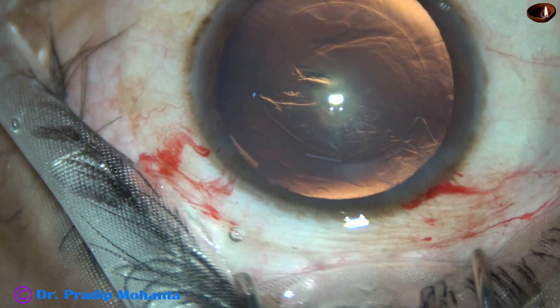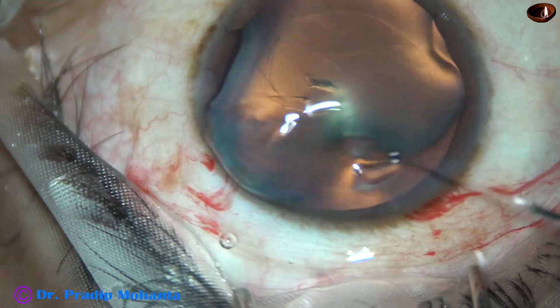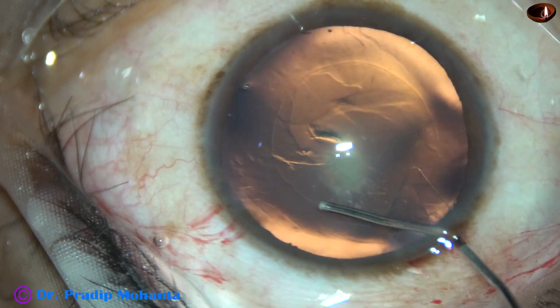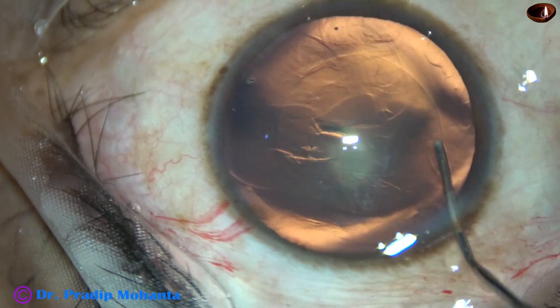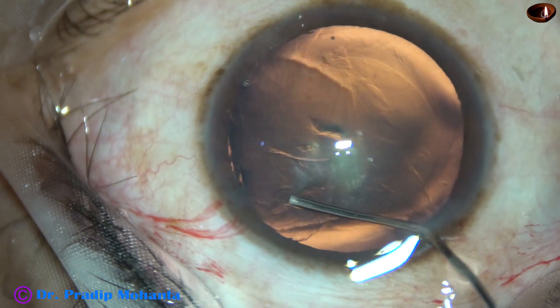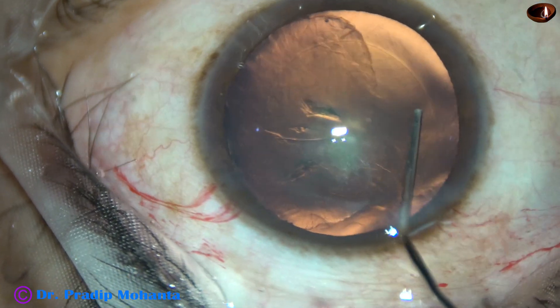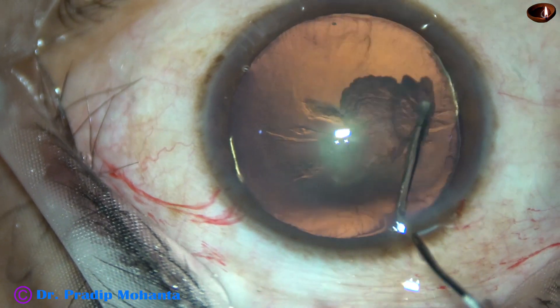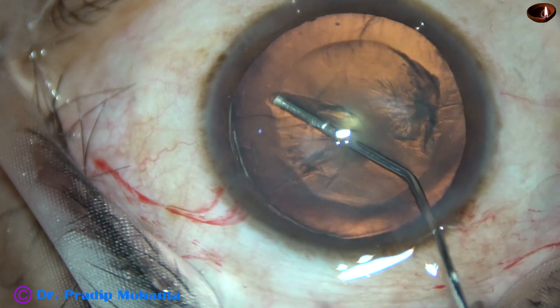Now hydrodissection is being done using a 27-gauge cannula and BSS, with the intraocular pressure on the lower side. Very gently, half of the wave goes and stops at the center, then the other half, and then hydrodelineation.